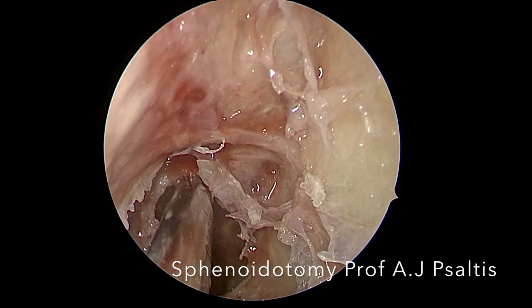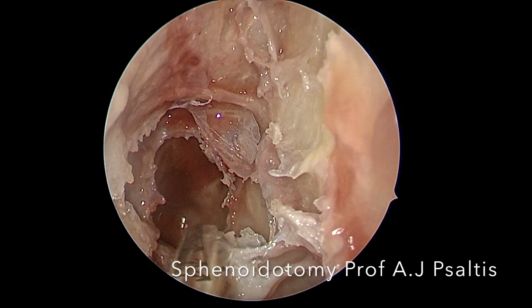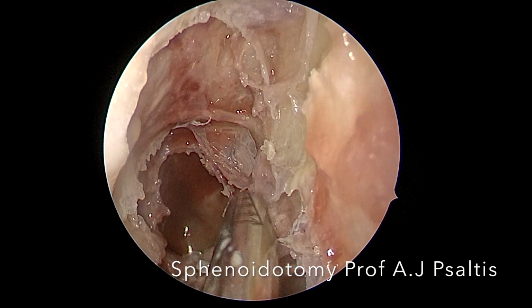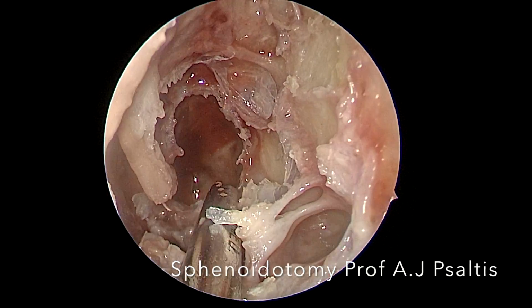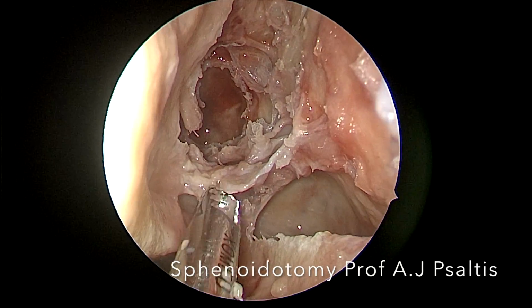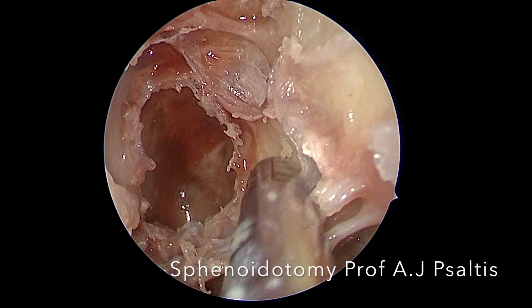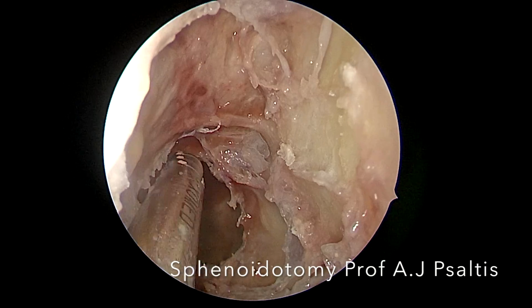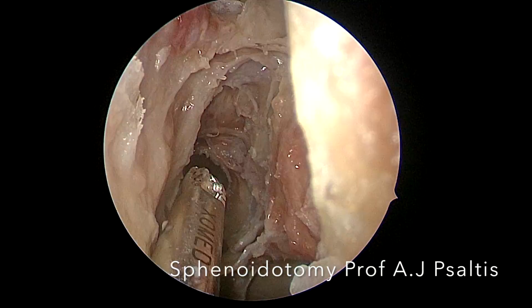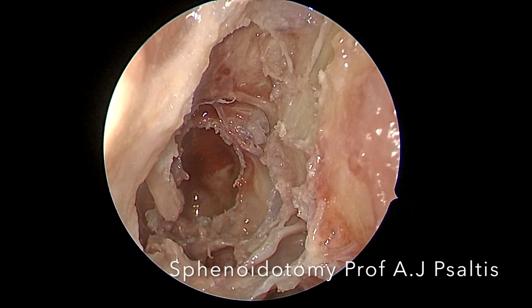Once this has been performed, we can then address the final partitions along the roof of the ethmoid sinus on the way to the frontal sinus. This is best done with a 45-degree scope. At this stage, we are simply tidying up any bits of the soft tissue before we turn our attention to those ethmoid partitions that I was speaking about before.